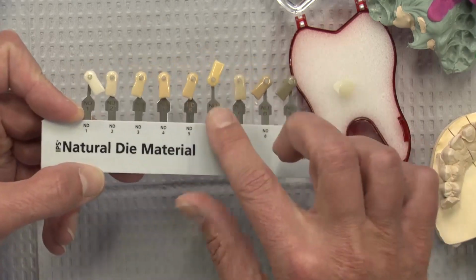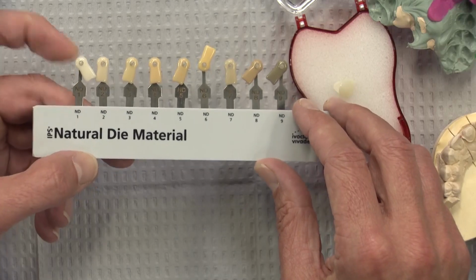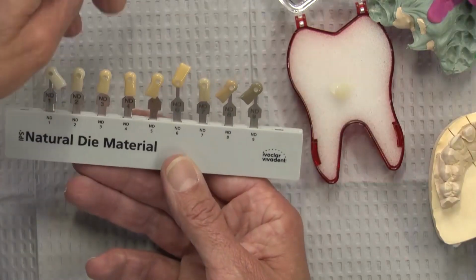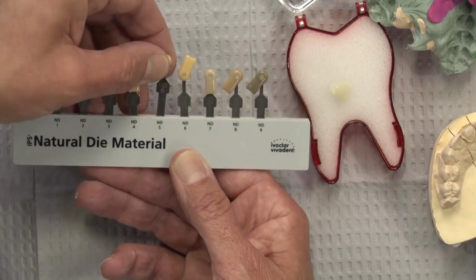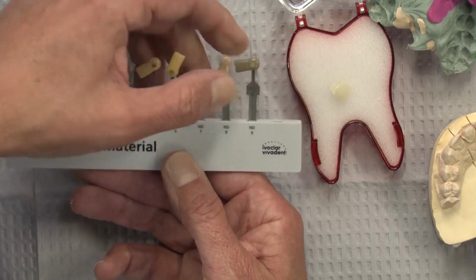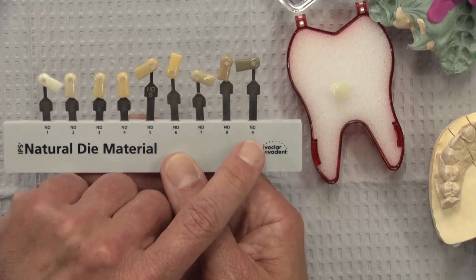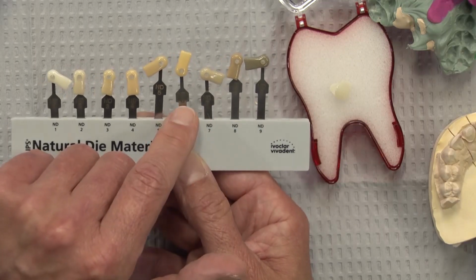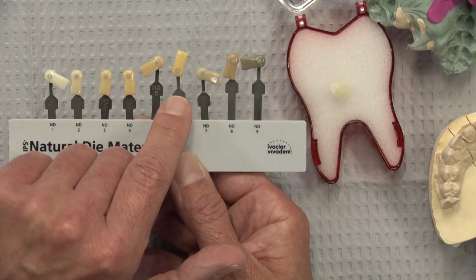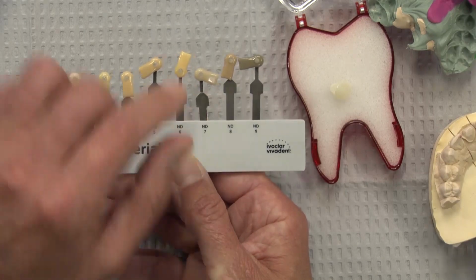And they can even combine these together to make their own shades. But pretty much the rule of thumb here is that once you get south of, say, ND4, so all of these over here, the 5, 6, 7, 8, and 9, if the stump shade is a really dark gray or a brown, or this one actually, even though it's not an awful shade of yellow, perhaps, again, the value is so high that that's going to show through those crowns as well.